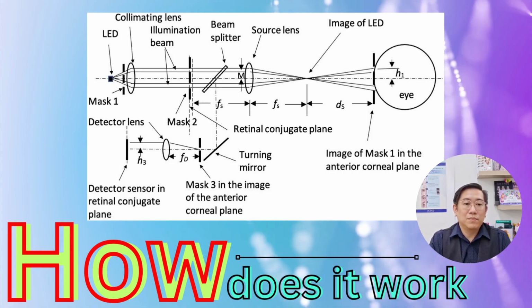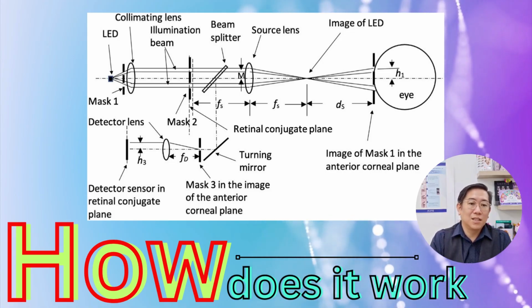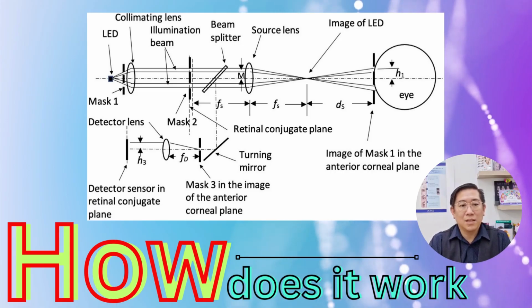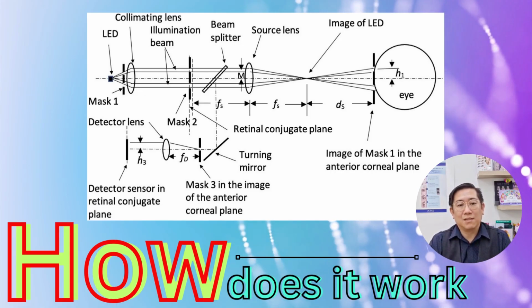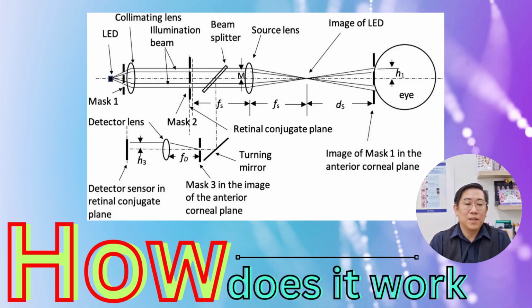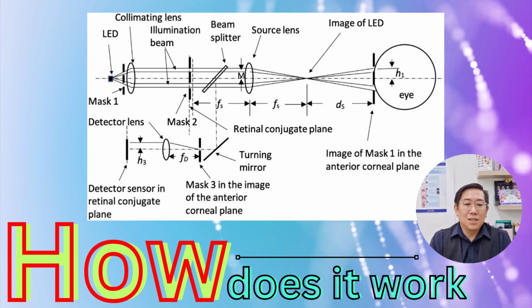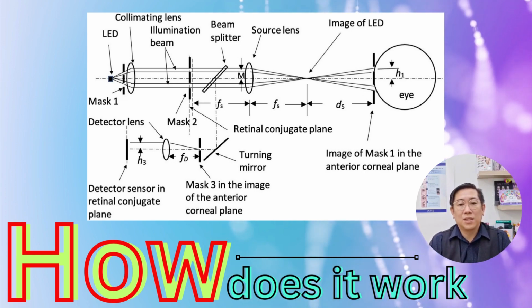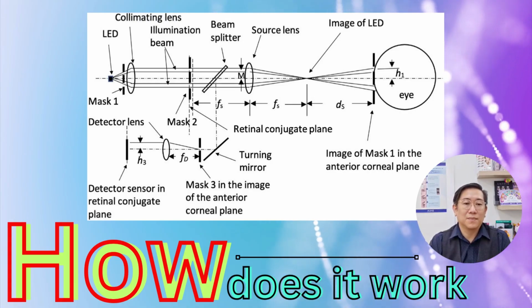For the final output, the device then displays objective results such as spherical and cylindrical error, axis of astigmatism, corneal curvature if it's integrated with keratometry, and axial length or IOP in some models. This data helps the optometrist proceed to subjective refraction or further evaluation.